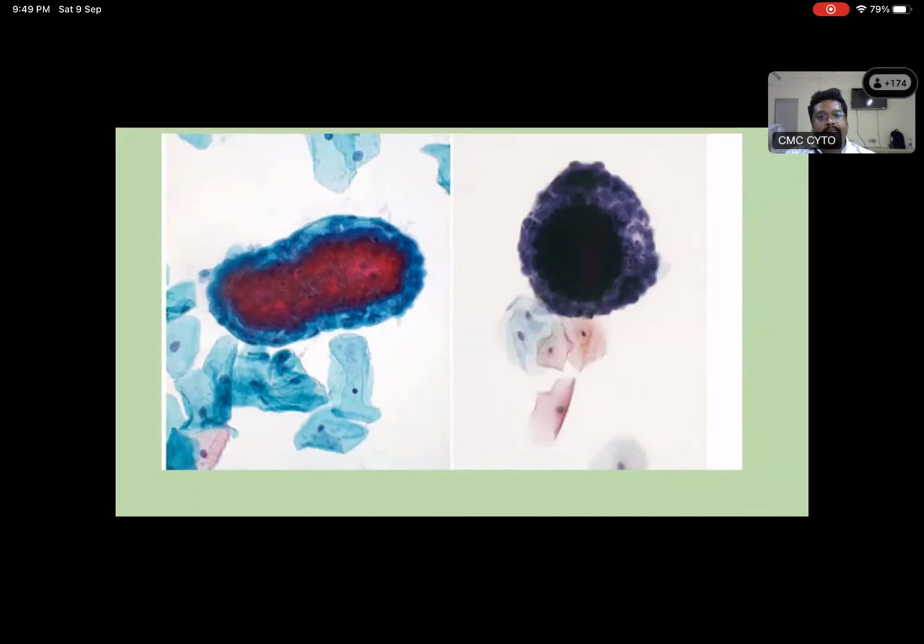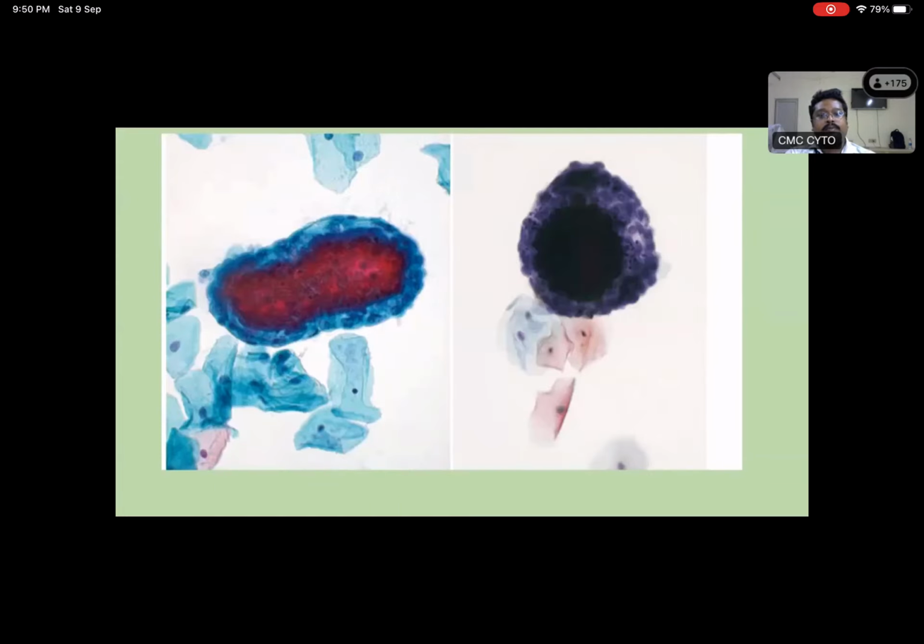The next one. We'll go to the second spotter. Next one.